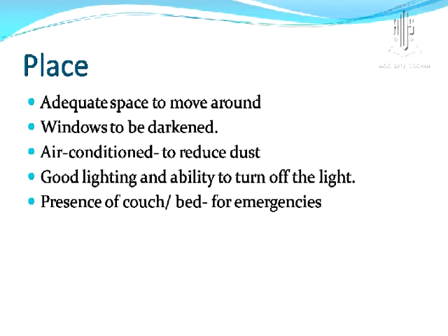Good lighting is necessary so that you can cannulate the vein, and you should have a couch or a bed in case of emergency. Patients do have problems when undergoing fluorescein angiography, so you should be able to make them lie down somewhere if there is a problem.